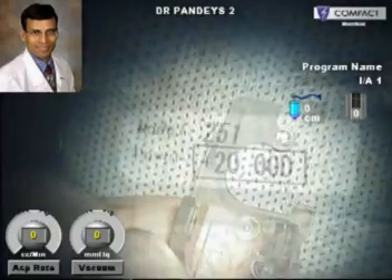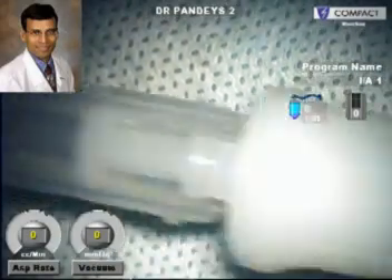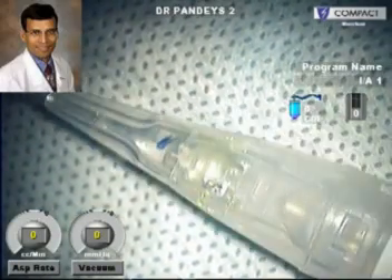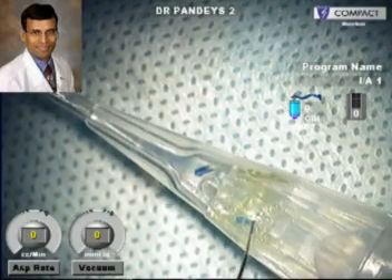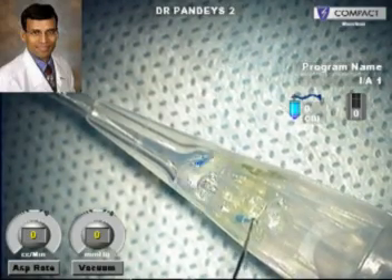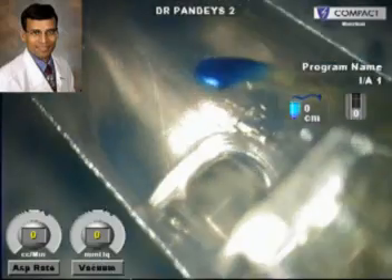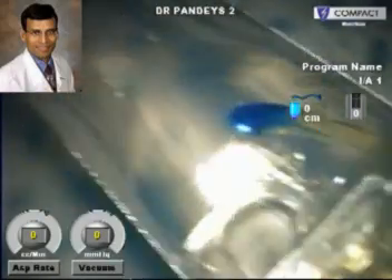Viscoelastic is injected into the infusion port. It has to be injected in a direction perpendicular to the injector, taking care not to touch the IOL inside with the tip of the cannula being used to inject viscoelastic. As seen here, this is the viscoelastic being injected, and there are dotted lines on the front and the back. The viscoelastic has to be filled right up to these dotted lines on the two sides.